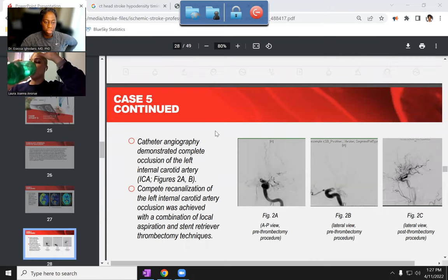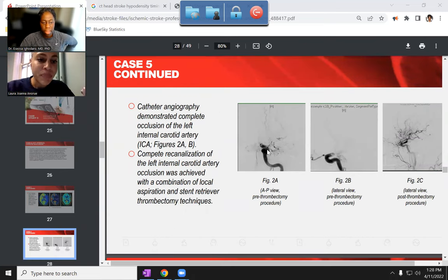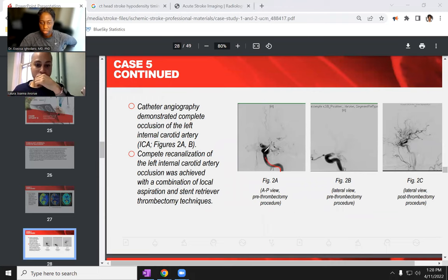So then they do a CTP, then they do a cerebral angiogram, and it looks like they were able to remove the clot. So for blood vessel practice, what's this blood vessel? ICA. Fantastic. That is the only one I can really pick out. Yeah, same. That might be ACA, maybe MCA, that little big chunk. Oh, that's a tough one.